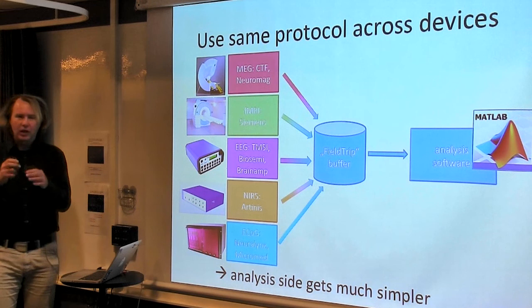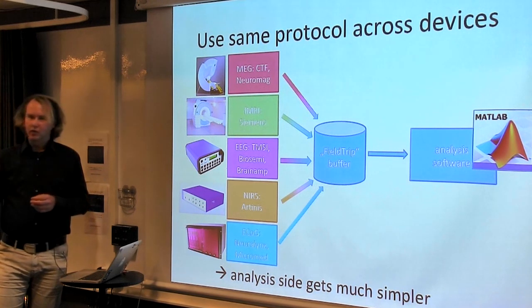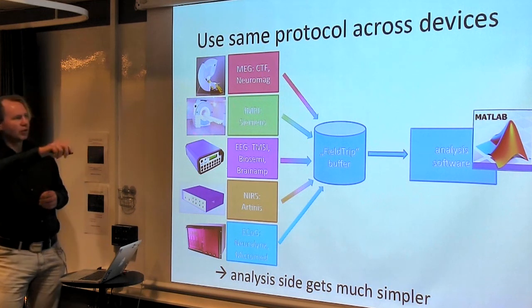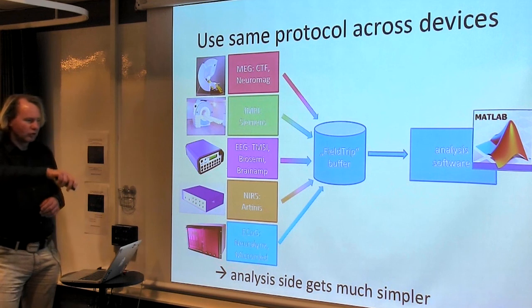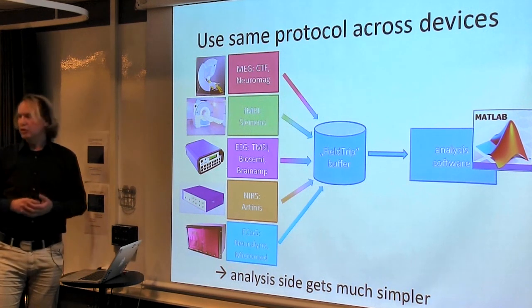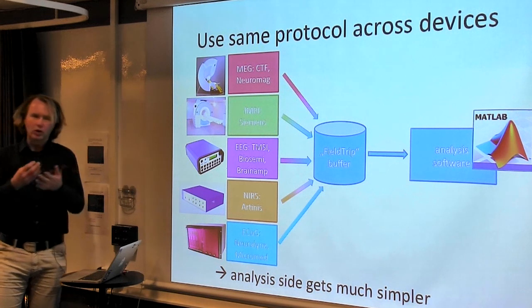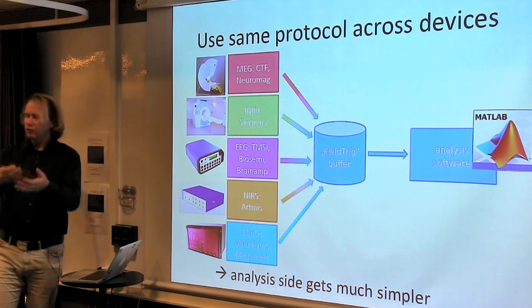They all sample at different locations in time. Sometimes time is very slow and locations are very many, such as with the MRI scanner. And sometimes time is very fast and the number of locations is relatively low, such as with the ECoG. But in general, they all allow us to represent data in the same way, which means that if you learn how to work with one of these devices, you can translate that knowledge to one of the other devices.